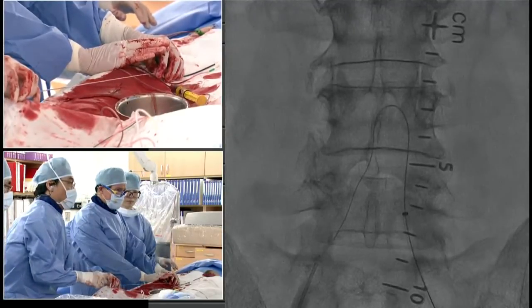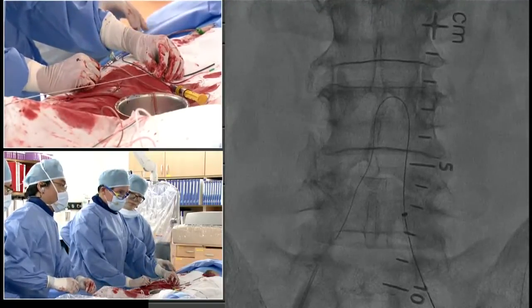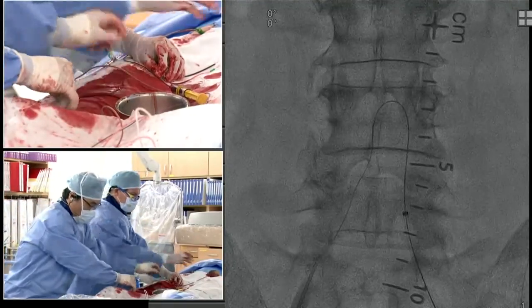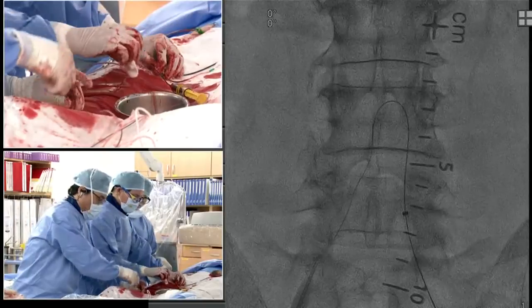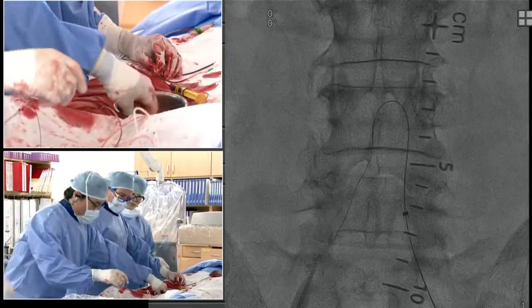So we're taking the Omni out. Dr. Heuser is now gingerly leaving the wire in place and trying to bring a catheter around the horn, which will sometimes work, like a quick cross or support catheter of some kind. Cross 018 usually works. Yep.